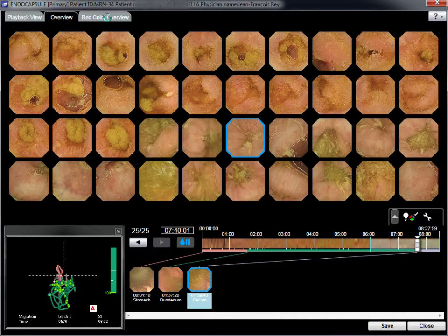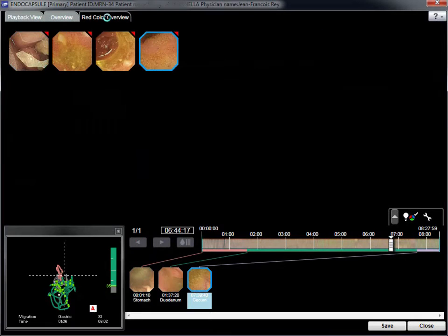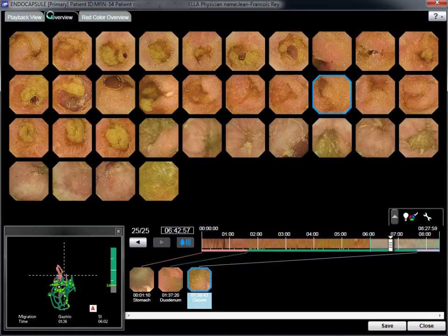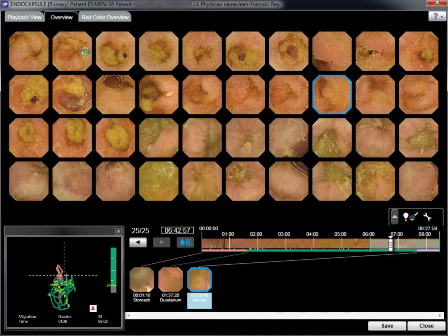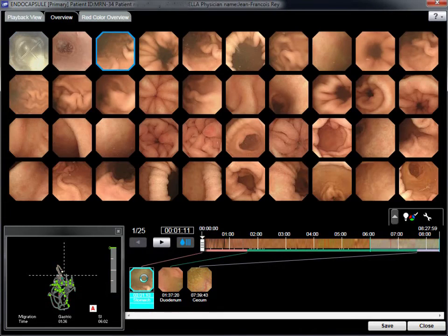The red colour overview does not show any sign of bleeding. In overview mode, some debris appears in the last part of the ileum. However, the normal mode must be used to find the abnormality.